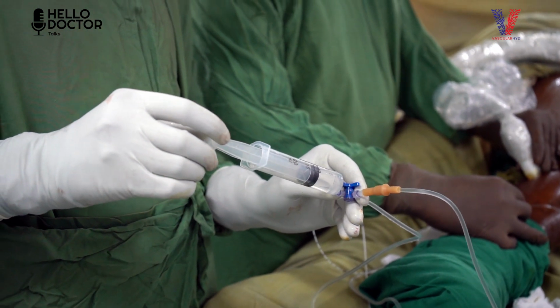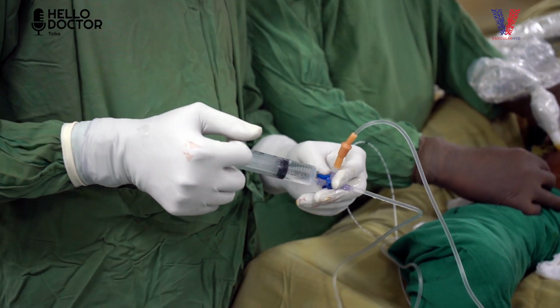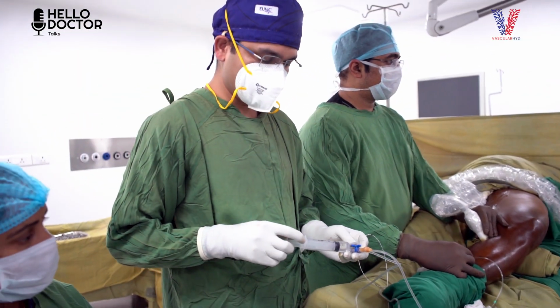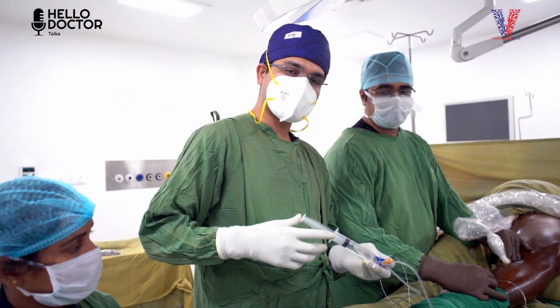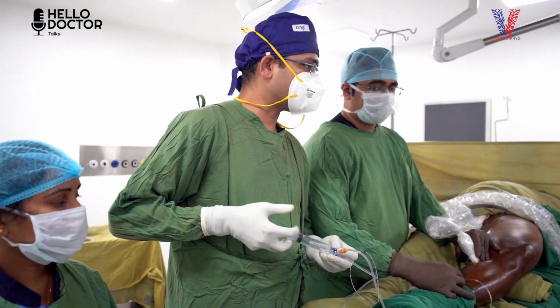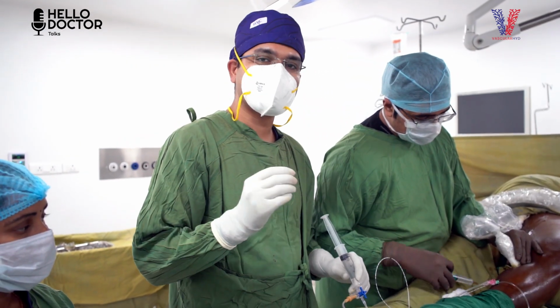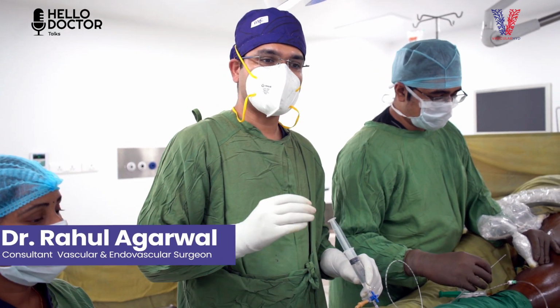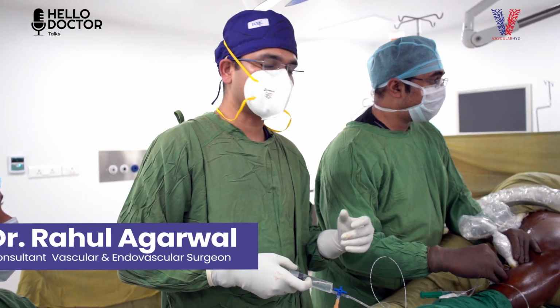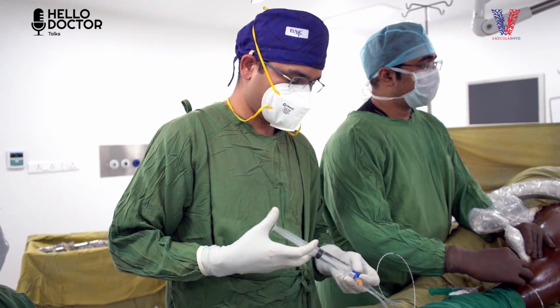Then inject. We keep reloading again. That's all. When it's ready, inject. So within the time I reload my syringe, the expert doctor puts his needle and positions it along the fiber in the fascia, and I am ready for the next injection. Under ultrasound, we watch where our fluid has traveled along the fiber, and as soon as we see that it is no more extending or progressing in the fascia, then we take a new puncture and get a new access along the same fiber.